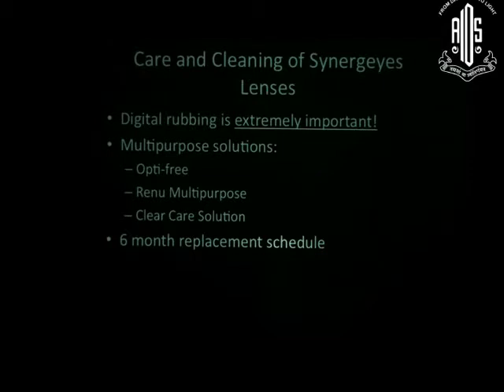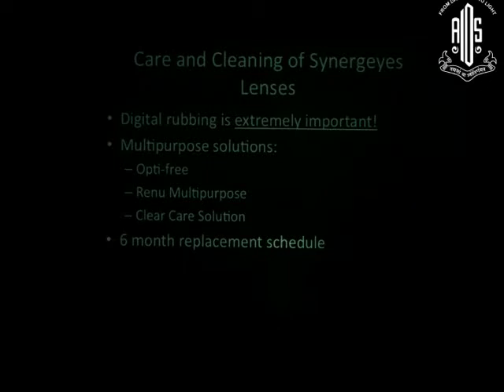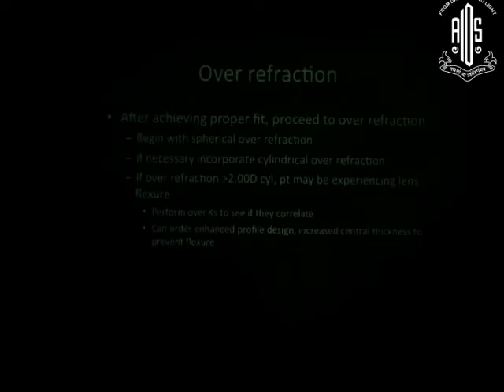The most important thing is that the care of these lenses is extremely important. You have to have a proper multi-purpose solution, preferably Opti-Free Replenish from Alcon. And these lenses are 6-monthly disposable lenses, which has to be really told to the patients. There are a lot of patients who wear them over 2 years, 3 years and they come with irritation in their eyes. And a good over-refraction is important. The most important thing for these lenses is that, irrespective of the vault that you have, your over-refraction has to be the same with each and every lens. So it should not change with increasing or decreasing the vault.